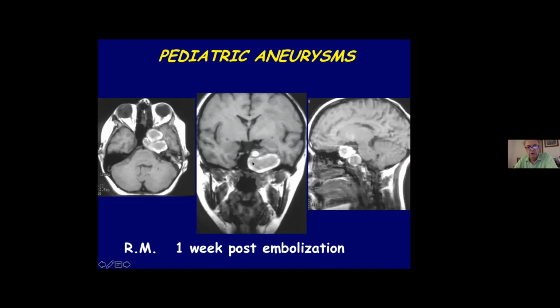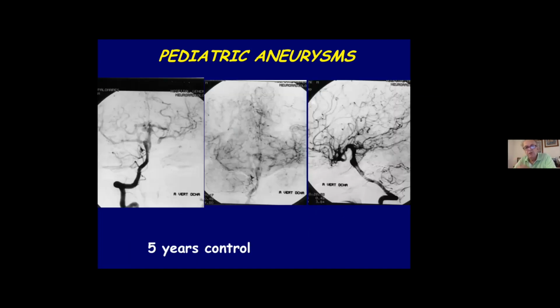Total occlusion of the aneurysm by the balloon. The patient recovered slowly from the hemiparesis. The evolution was good, but 5 years later, I had a control.